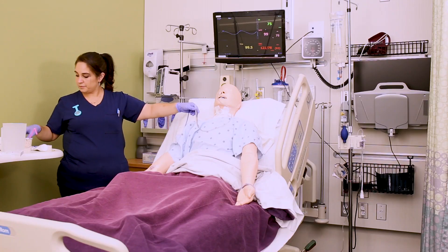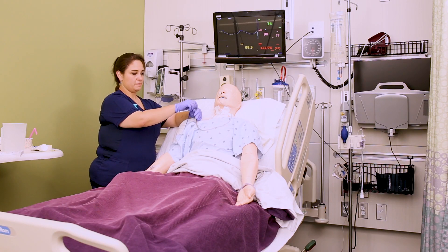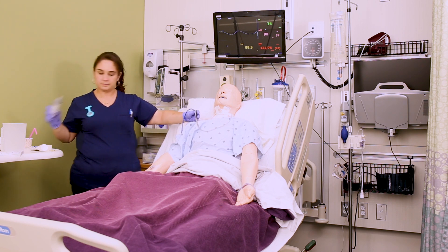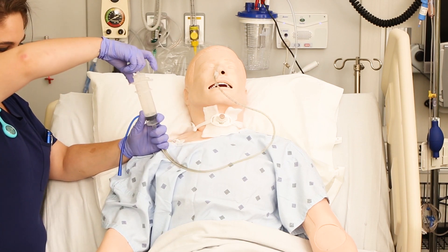Make sure that as you're flushing, you're counting these as intake measurements. Now, if the patient has the NG tube for gastric decompression, we'll still flush but reattach it to suction right away, and everything you suction out gets counted as output.